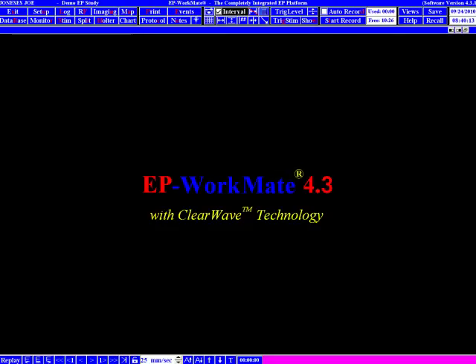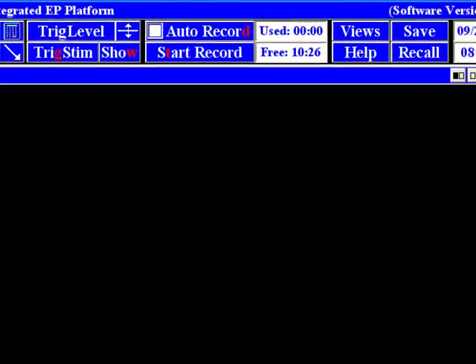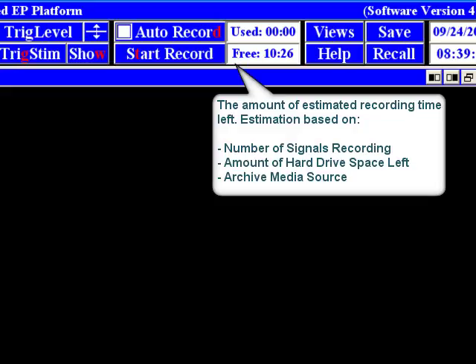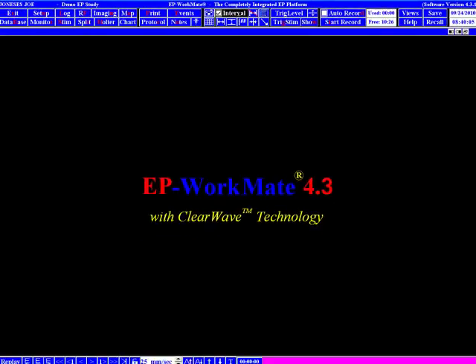Everything else about the EP Workmate Recording System program is controlled from the toolbar at the top of the Review screen. One section to bring attention to is recording, the amount of hard drive space left, and the archive media source. The archive media source is important because the EP Workmate Recording System will not allow you to have a case that is bigger than the archive media source. For example, if you're using an 8.5 GB dual-layer DVD, each side is approximately 4.7 GB, so one case will not be allowed to be larger than 4.7 GB. The system does this so that cases are not split between different sides or different disks.